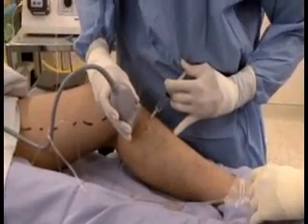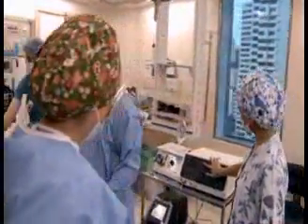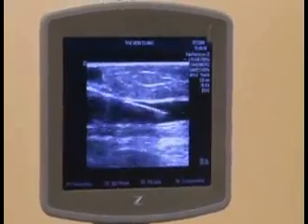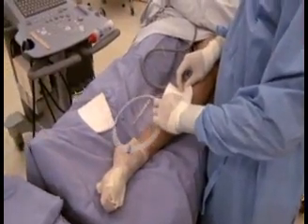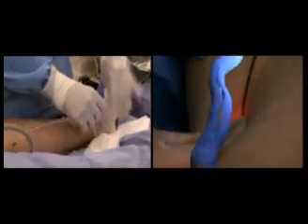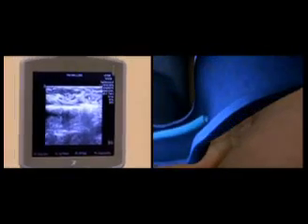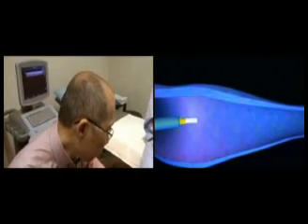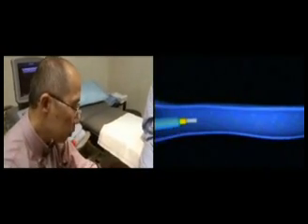But that all changed with the advent of laser therapy. Vascular surgeon Dr. Tan offers a radical alternative to the traditional stripping method. The quick and painless procedure is known as endovenous laser technique, or EVLT, and it's revolutionized his field of surgery. What we will do is we will laser this vein, and most of this surface vein will actually resolve by itself. And those that don't resolve, we usually will give them some form of injection.